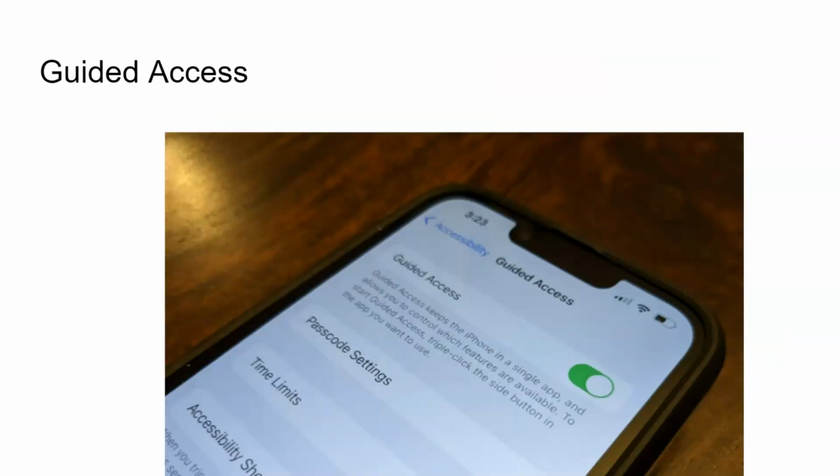You may notice that this device has been placed in guided access. This is basically a setting that locks you into the application that you are using. We do this because as a student is learning to use a communication device, it is best for them to see it as a tool for communication or their voice versus as an iPad. Kids are used to iPads for playing games, watching movies, or having some free time. That's all fine and good when it's a device that's open to them. But for communication purposes, the app needs to be always available.